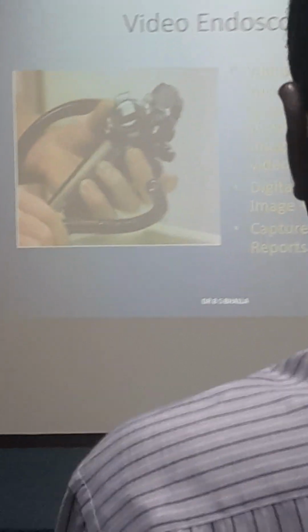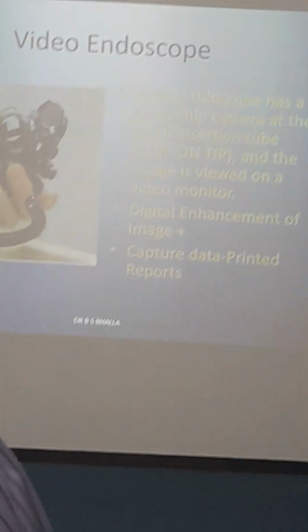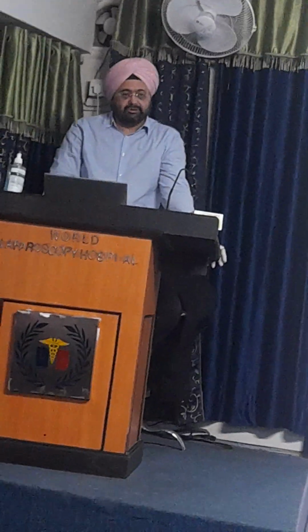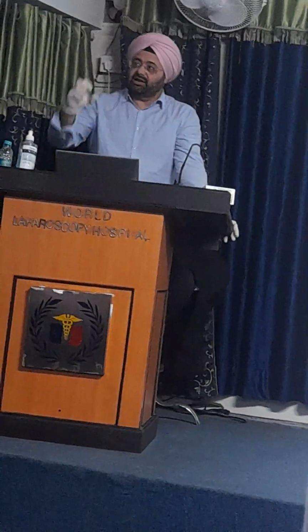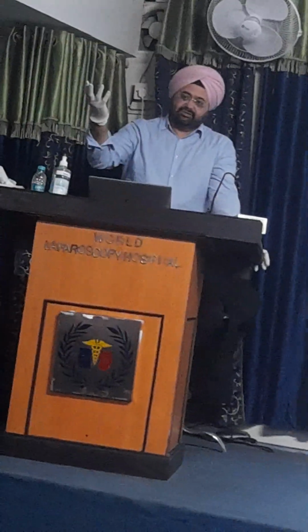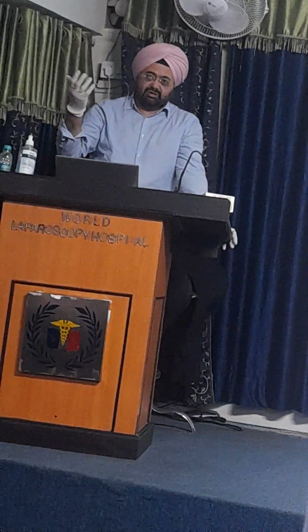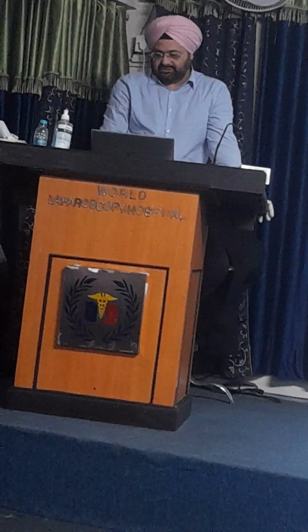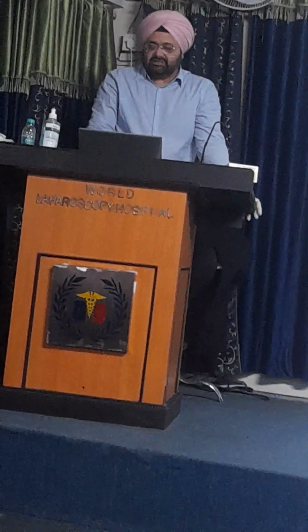Video endoscopes, on the other hand, because they have a CCD inside, give you an image. And once you have those signals, you can modify them. You have all the features, including white balance. As you do a white balance for your routine cameras, you do a white balance for your endoscopes. So all the features are available. You can magnify the image. You can freeze the image. You can capture the image. All these are possible because it is signals which are being transmitted, and we can modify and capture the signals. So this gives you an advantage.